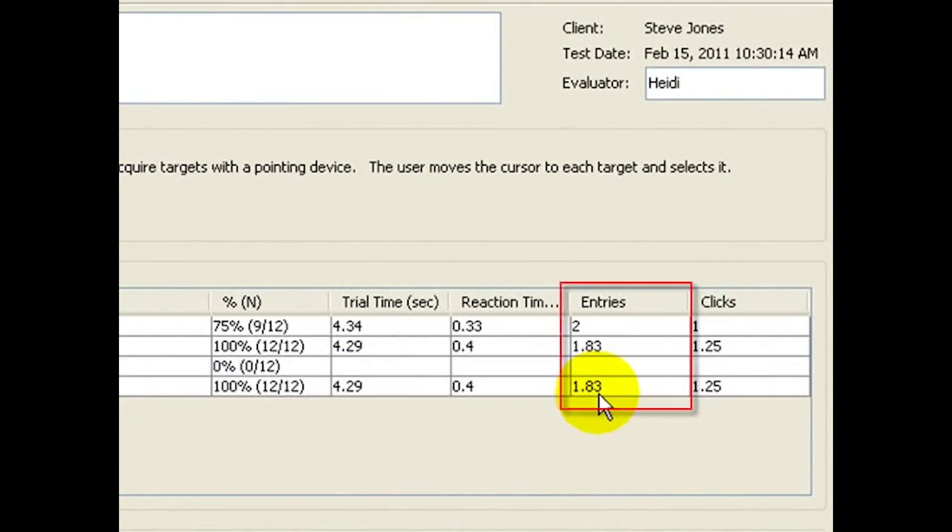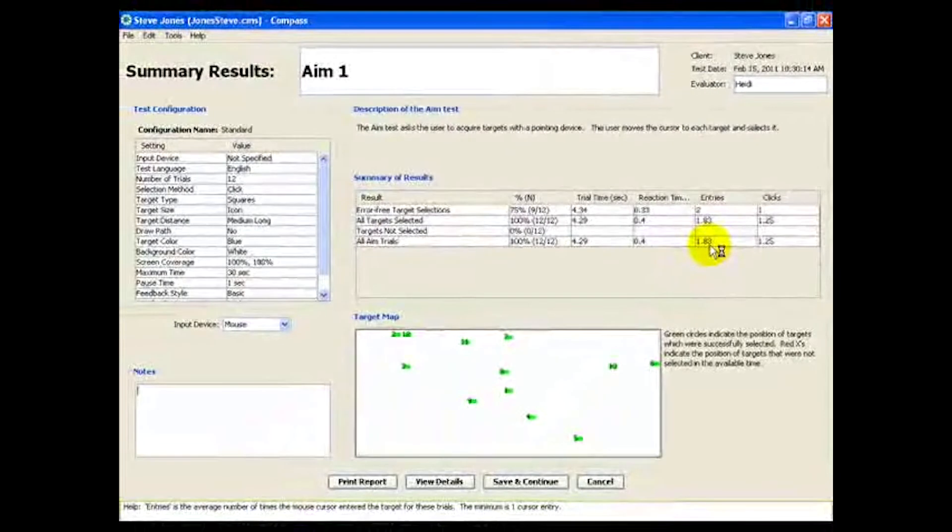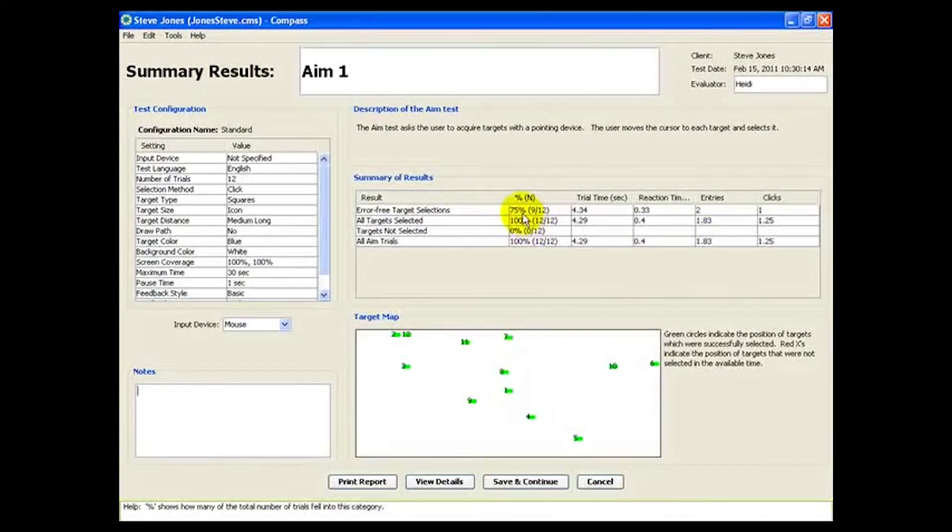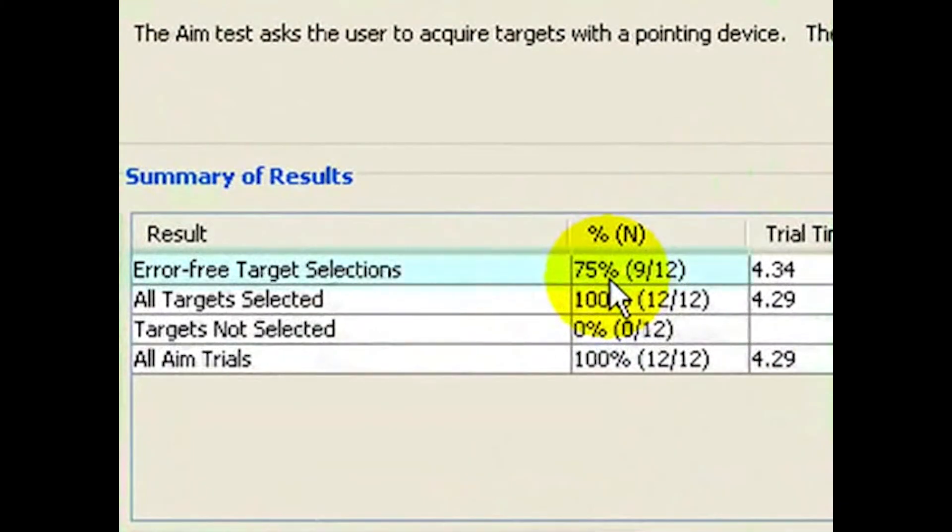For example, entries measures how many times the mouse cursor entered the target during each trial. A nice measure of accuracy is the percent of error-free trials. Here, it shows that Steve selected 75% of targets using just one click.